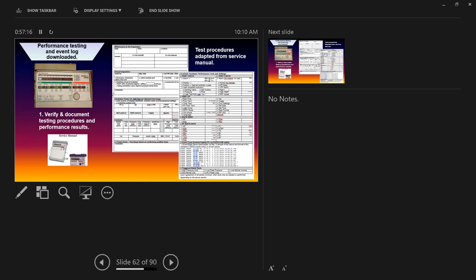Get the service manual, obviously, and keep your model there. I was fortunate to get an exemplar, the exact same model of that ventilator, and the service manual, and I just went through it diligently, over a couple of months, relearning everything about that ventilator, how it's tested, how to use it, how to set the alarms. And I came up with a whole set of test procedures based on the manufacturer's recommendations. This had to get approved by both parties, potentially.